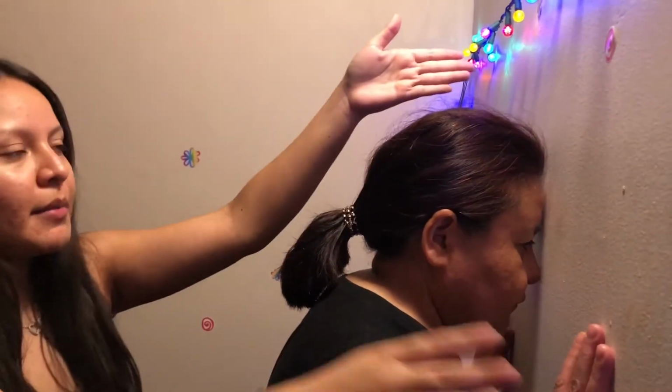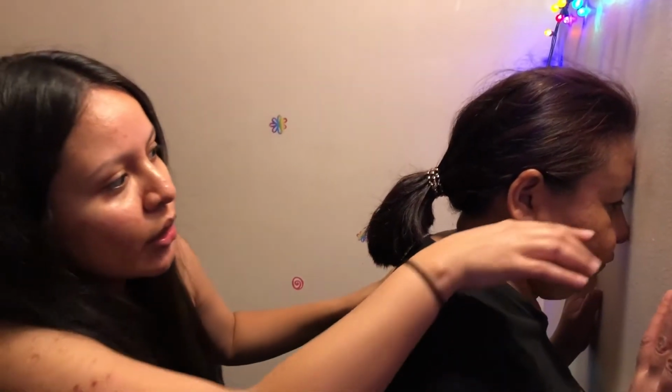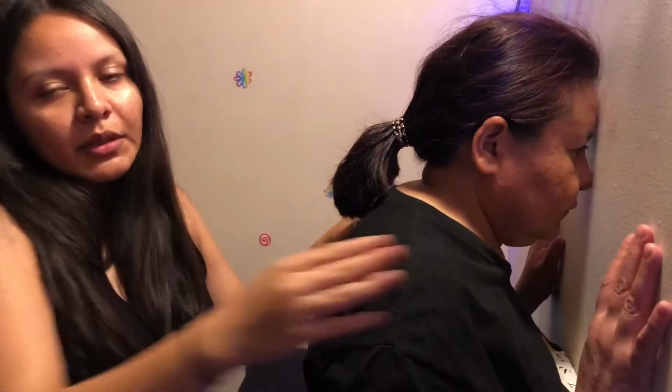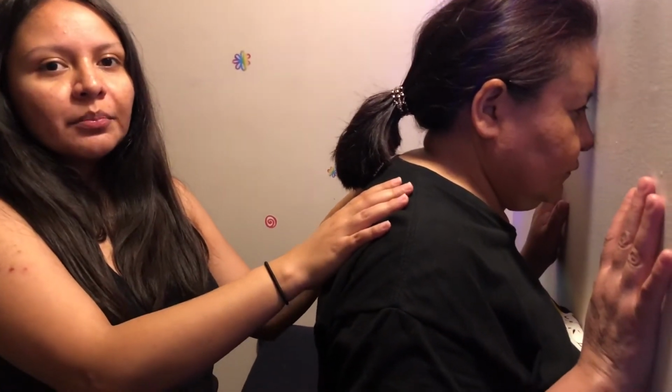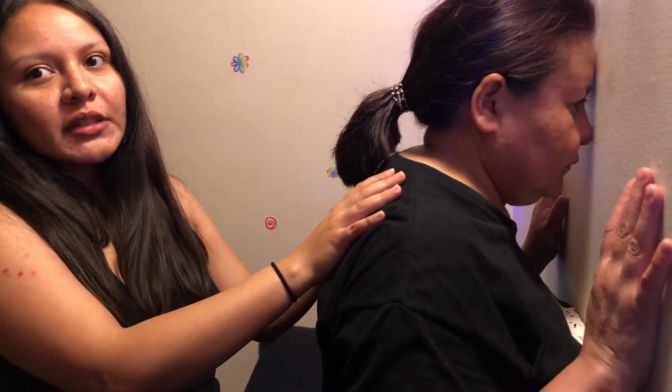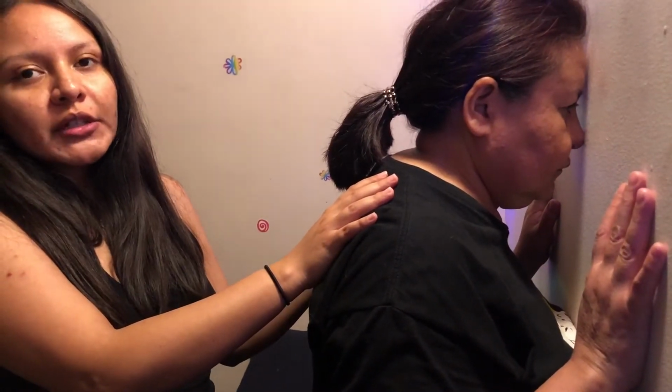We're going to have the MSP be perpendicular to the IR, as well as the OML be perpendicular to the IR, and the central ray is going to be coming in perpendicular through the skull at the nasion, which is right in between the eyes. And the technical factors that we would want are 12.5 mAs for CR and 6.3 mAs for DR.